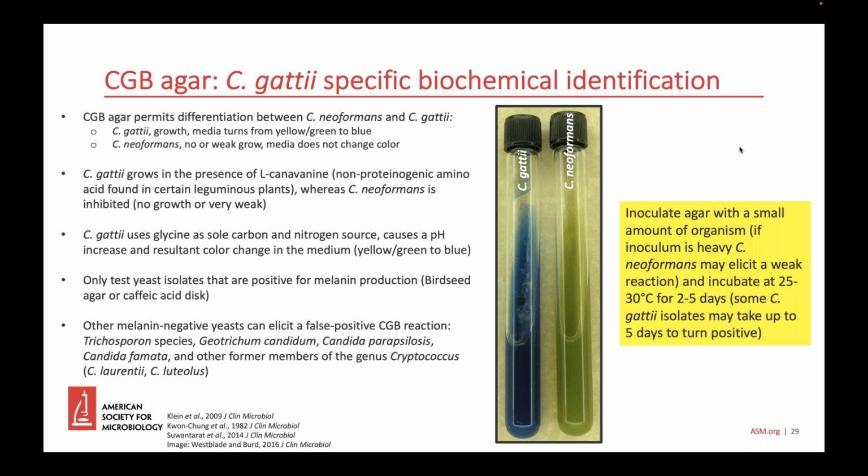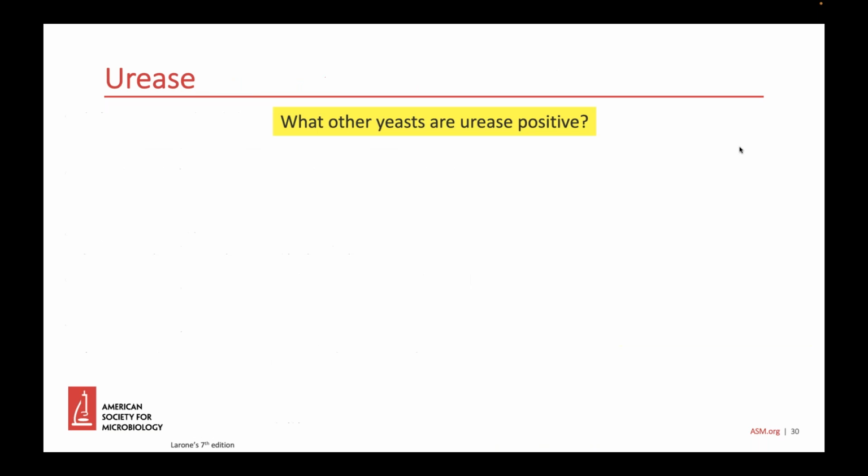And you can also generate a false positive reaction with neoformans if your inoculum is too heavy. So you want to use a light inoculum. Most strains will turn positive, and Gattii will turn positive in 2 days, but you may have to hold the media up to 5 days in order to see a positive result. So urease, isn't it such a beautiful test, biochemical test?